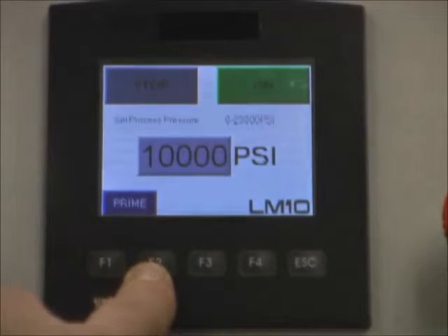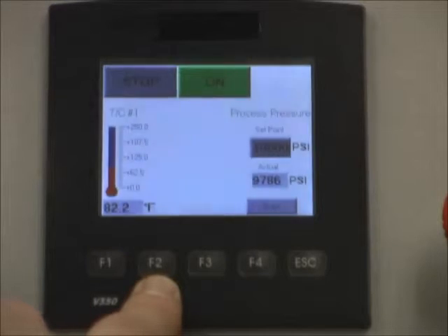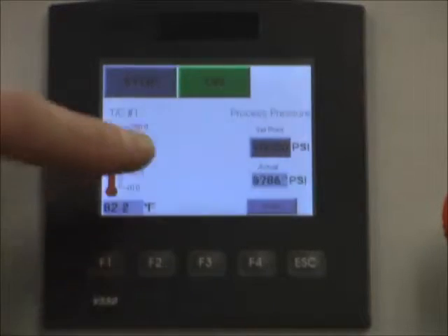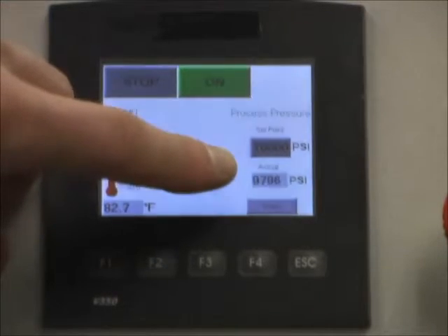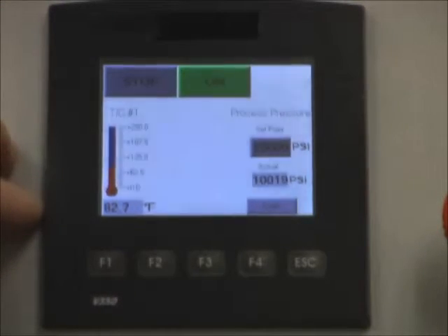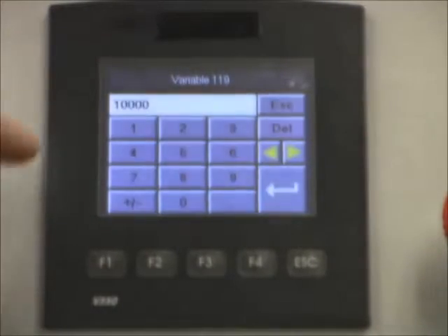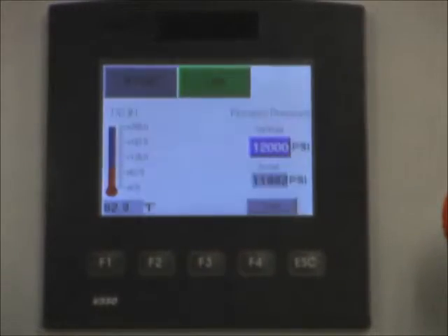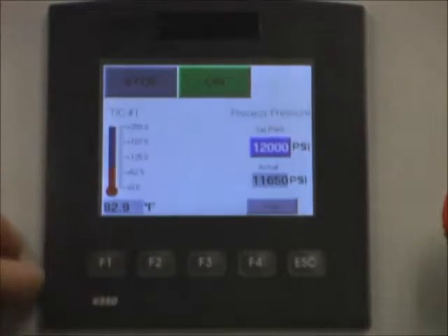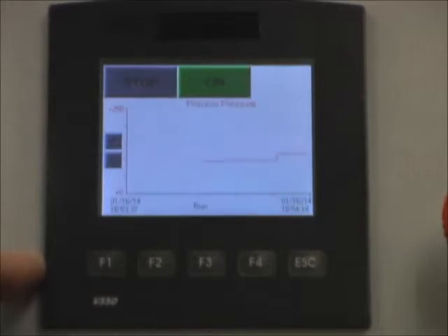We can walk through our screens again now that the LM10 is running. Here we can see our process pressure set at 10,000 PSI, as well as the actual pressure. We can press this button and change our pressure — let's go to 12,000 PSI and hit the return button. You can see the actual pressure update. We will touch the graph, and you can see the process pressure graph.